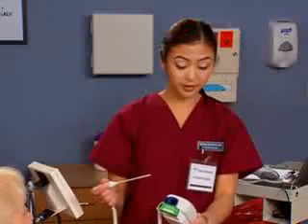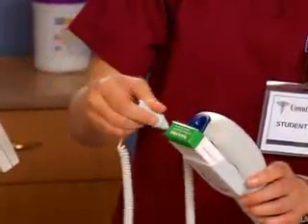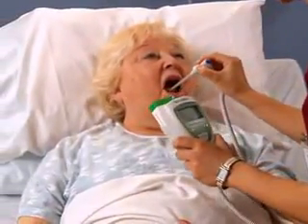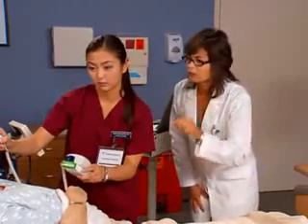Looks like the thermometer's ready to go. Remember the cover. Make sure you hear it click into place. Thanks. There. Open up, please, and I'll just place this right under your tongue. And if you could close your lips around the probe, great. And remember to keep holding the thermometer.